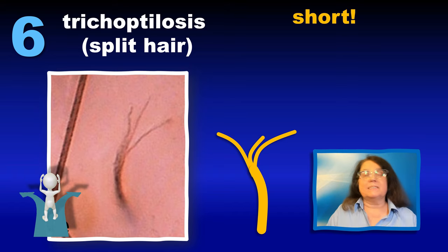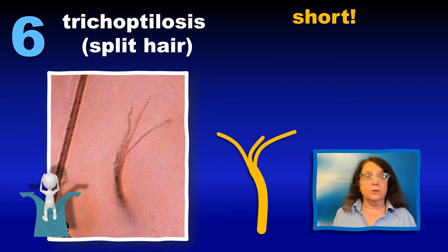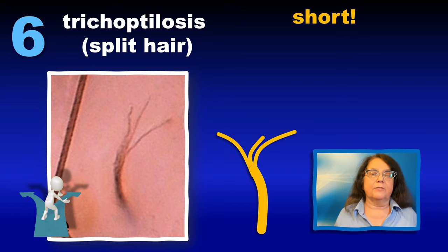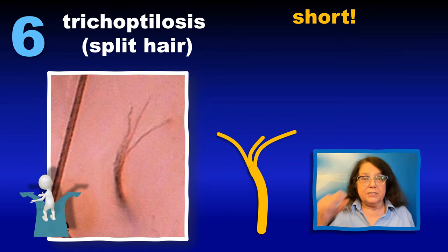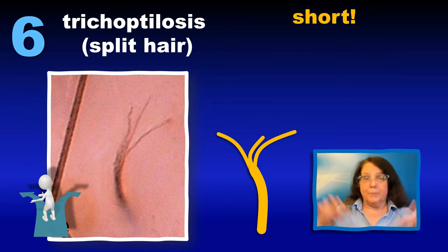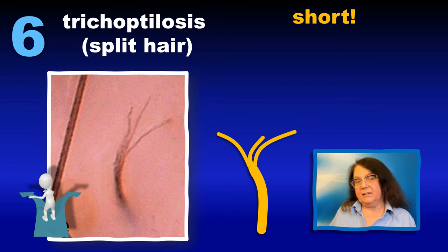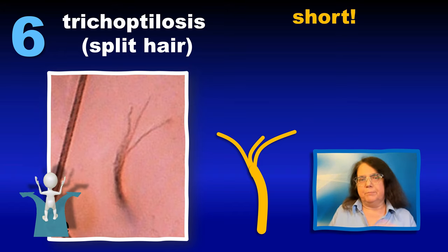When we think about split ends, what comes to mind is usually a person with long hair and a tendency to split ends of hair shafts over time. However, in trichoscopy, we usually see very short hairs. They are too young to split by physiology. And if we see split hairs, which are very short, this should make us suspicious about the possibility of trichotillomania.